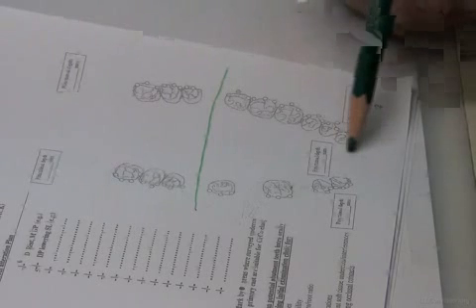Here. It's a plate. Major connector is no longer a bar, it's a plate. One of the indications for plating, anterior saddle area. Okay? The lingual.